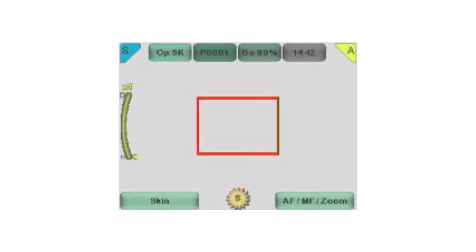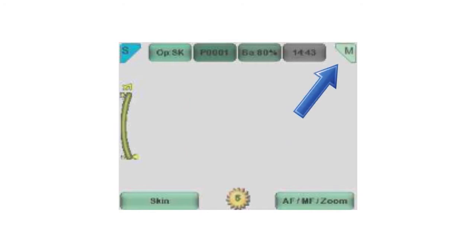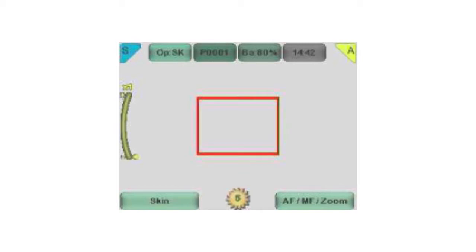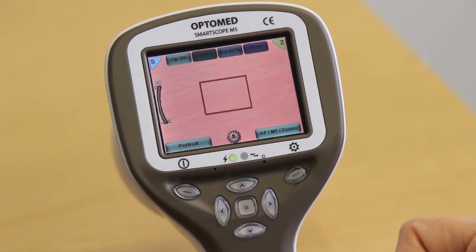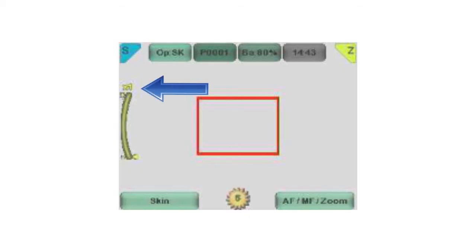Focus mode can be switched by short pressing the right soft key. The icon on the screen indicates the selection: M indicates manual focus, A for autofocus, and Z indicates zoom. It is recommended to use autofocus. When zoom is activated, Z will appear in the right top corner of the screen. There are four zoom levels: 1x, 2x, 4x, and 6x resolution. You can zoom in and out by pressing the arrow keys up and down. The icon on the left of the screen will indicate the zoom level.